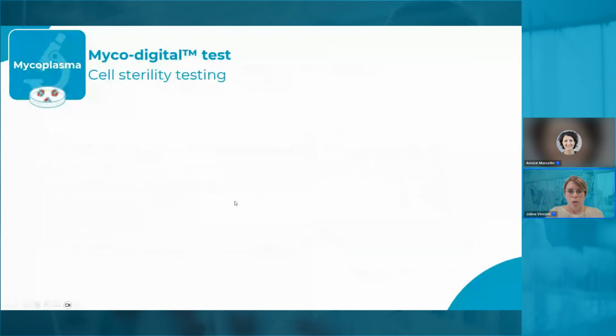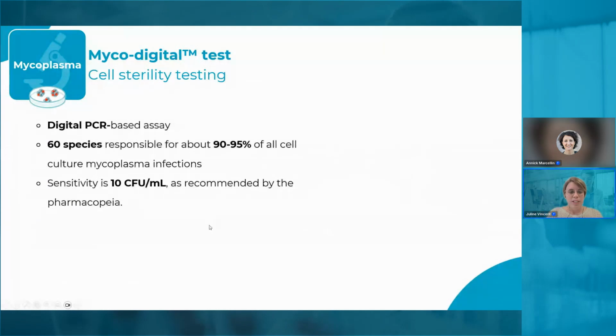And finally, to complete the essential quality control, you can use the mycodigital test to assess the absence of mycoplasma in your cell line.